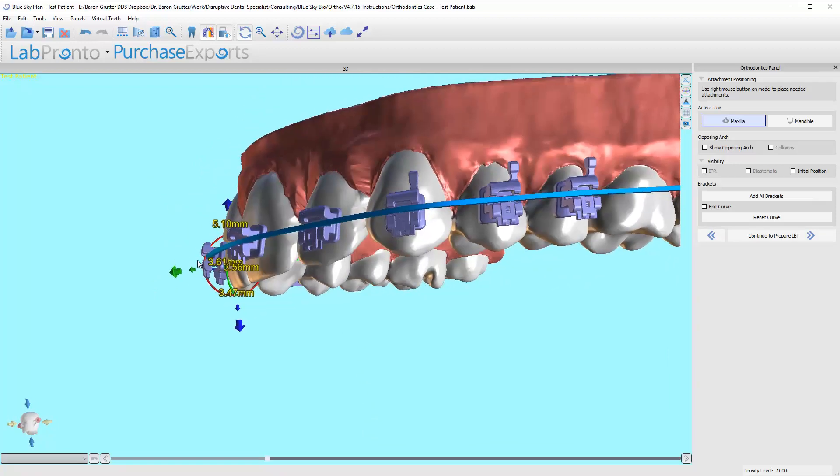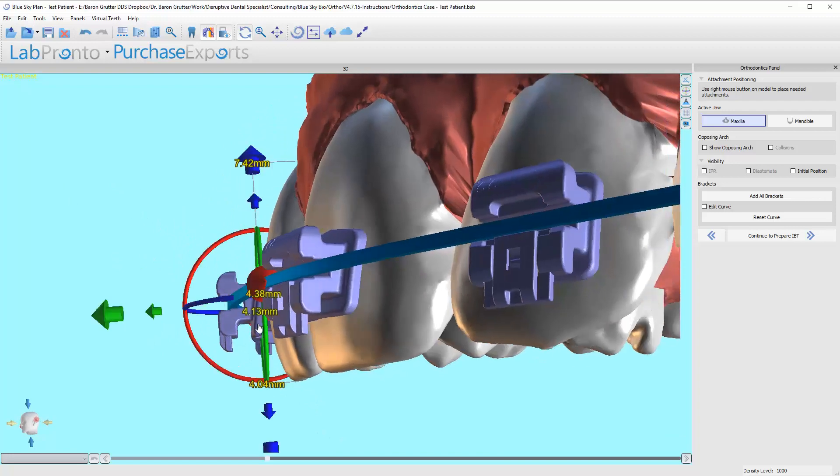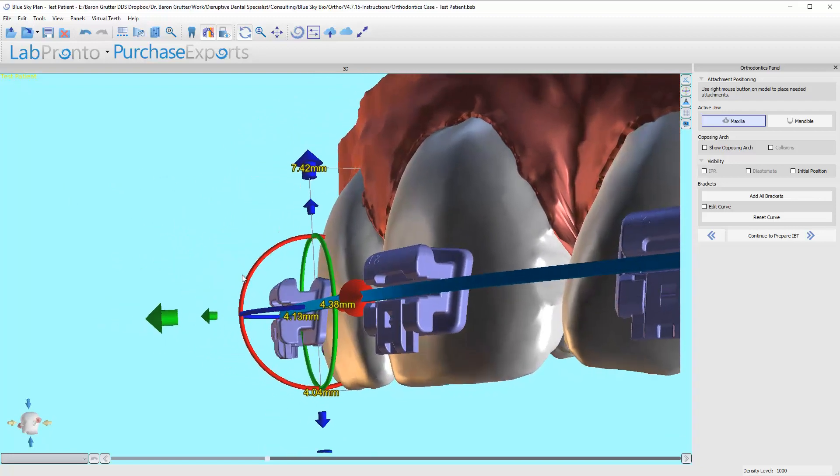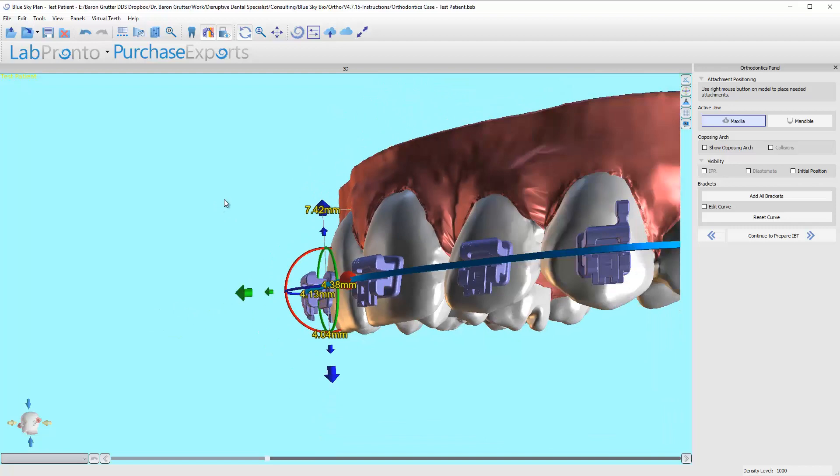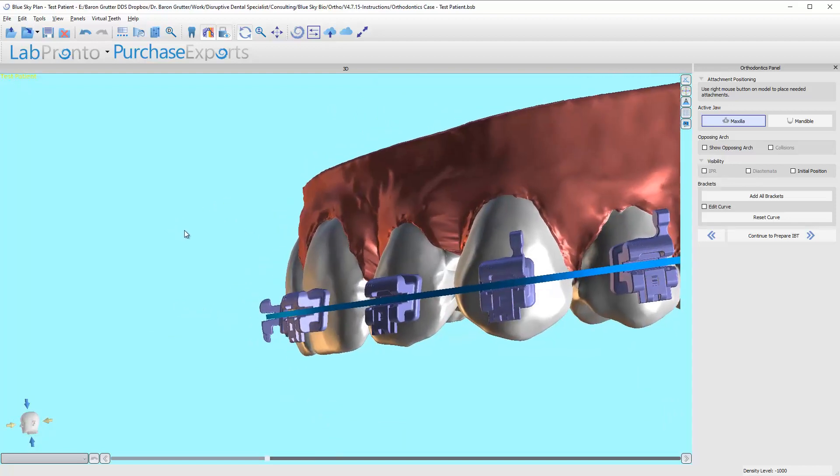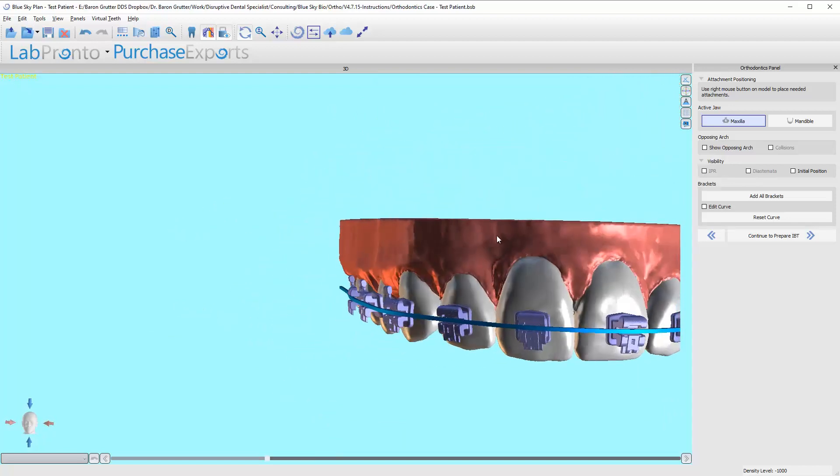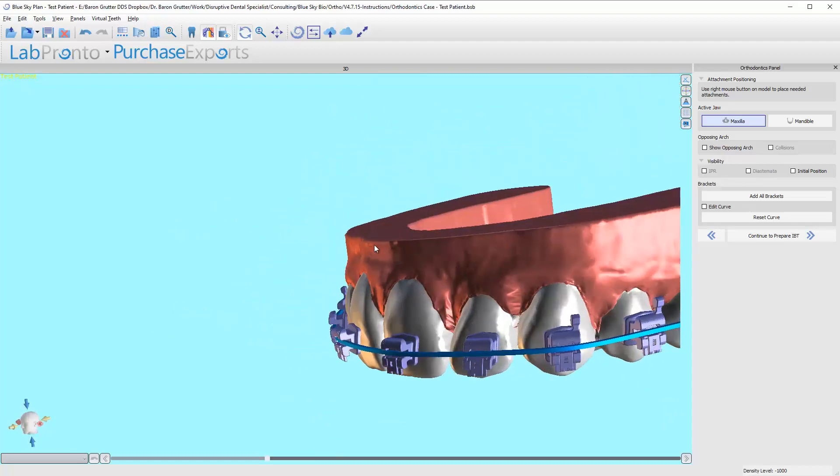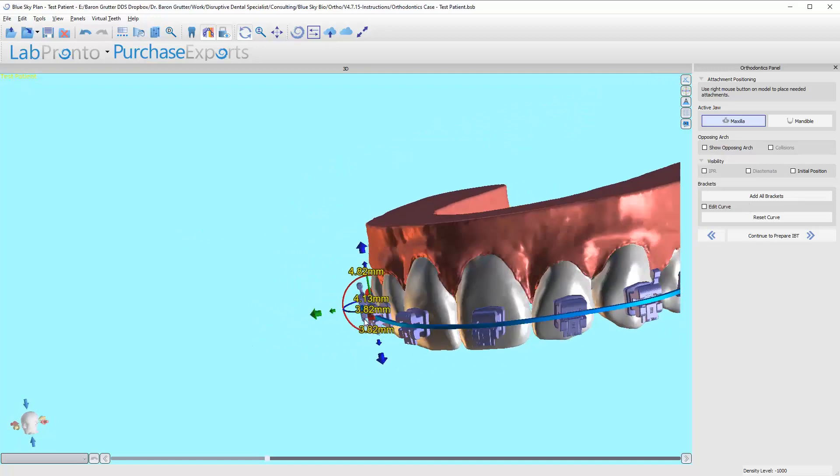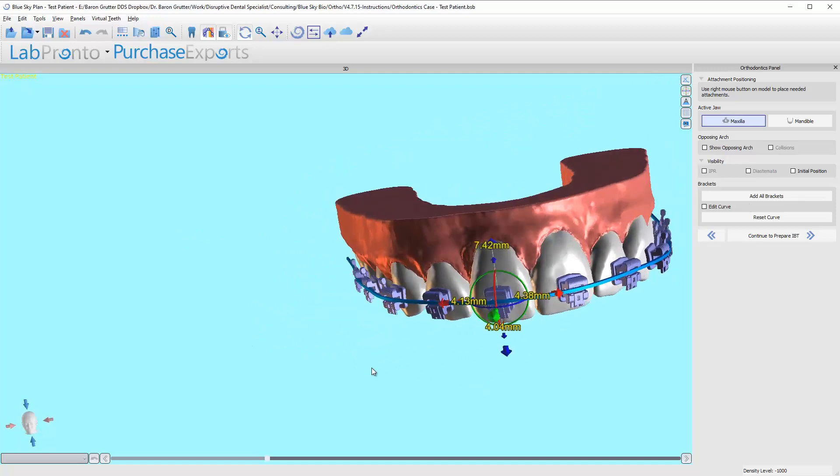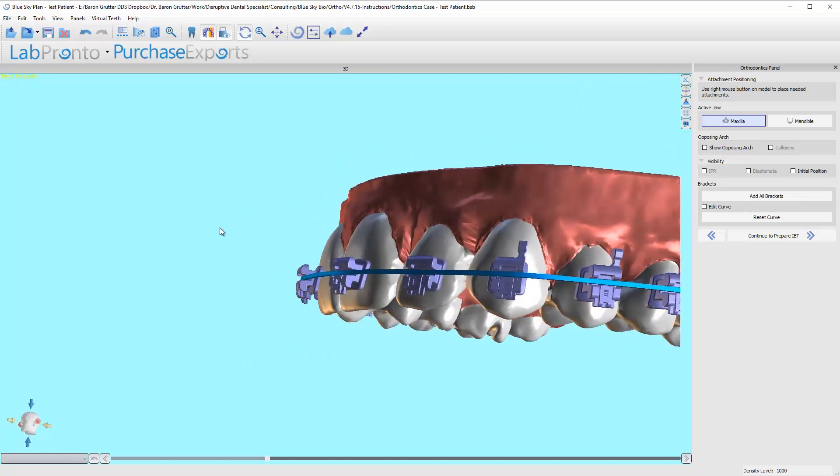Again, that's intentional. If you want, if this bracket for example, if this bracket was flush to it, as the bracket straightened out it would torque the root lingually. It would have to. So again, if you want to do that, that's fine, but you would have designed that when you align the teeth. You would have said no, I want these teeth torqued back.